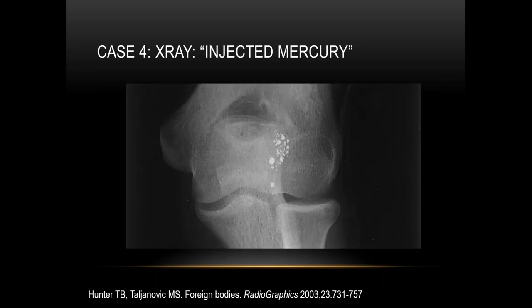This is an interesting case of injected mercury in the antecubital region in the soft tissues, demonstrating how radio-dense mercury can be.